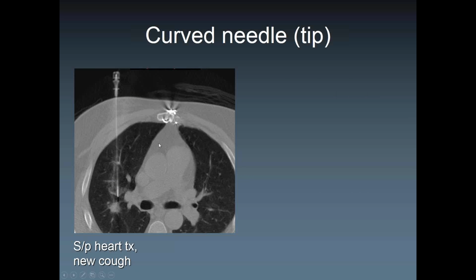Like this one here, where we ended up first doing a few shots that were kind of off. So this trajectory was okay, still no pneumo, that's good. It's a lung biopsy, sorry, of a patient with a posterior portion mass in here, probably the right upper lobe. Here's a fissure. And then the trajectory would be at the periphery of the target, which you can do, but if you want to sample more core tissue, so both is okay, just for the sake of sampling different areas of the target, you can also bend the needle.